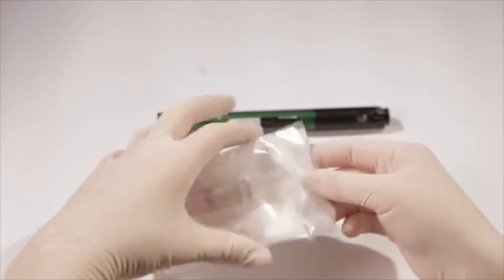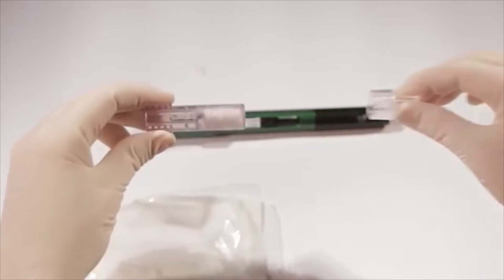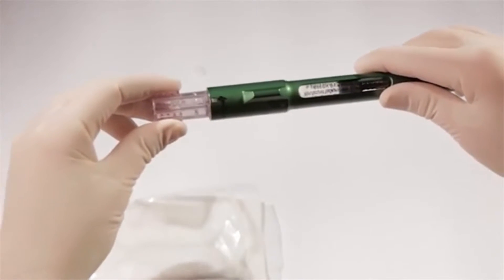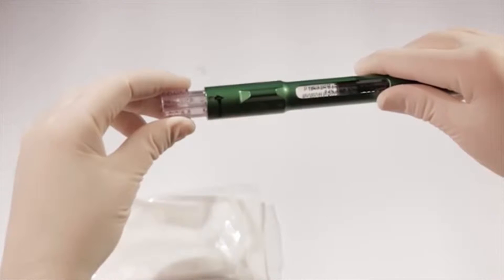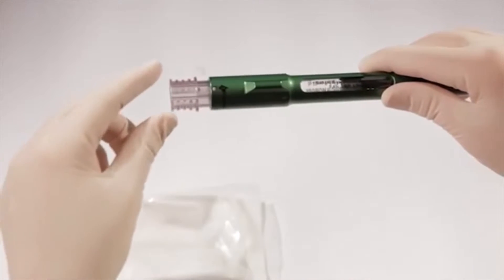Remove a disposable cartridge connector from its sterile packaging and carefully remove the safety cap. Don't try to twist or unscrew the cap — it can be easily removed by pulling it straight off. Align the arrow on the cartridge connector with the number one position on the pen's chamber and push in approximately one quarter inch until you hear a click. The number one position is where you'll insert the 1.8-milliliter cartridge before mixing.